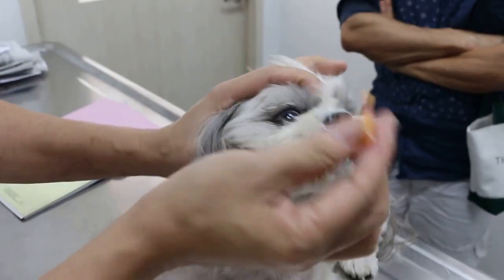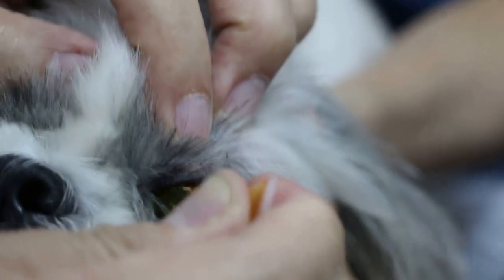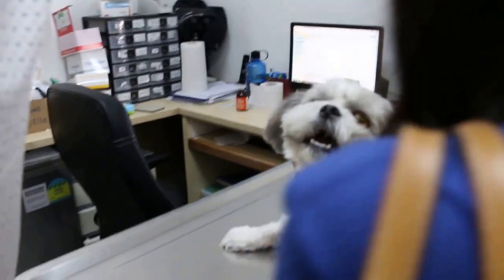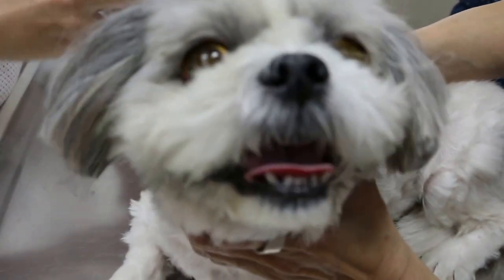Now I want to check whether there is an ulcer. Normally an ulcer will cause this problem. I'll do both eyes. I just put two drops in both eyes. Now when there is an ulcer, it will become green in color — the cornea. So we will check whether there is an ulcer. Ulcer is painful, so you keep on rubbing and keep on having discharge. That's why the eye did not recover. Wait one minute, then I will check.